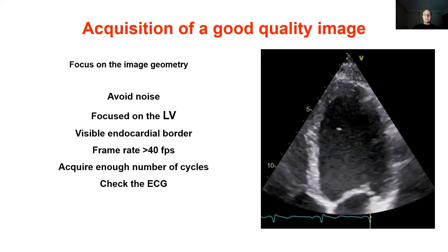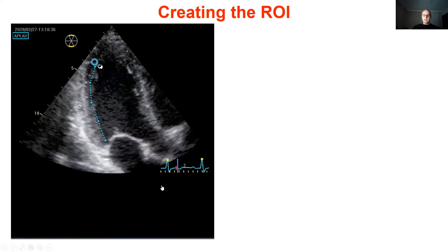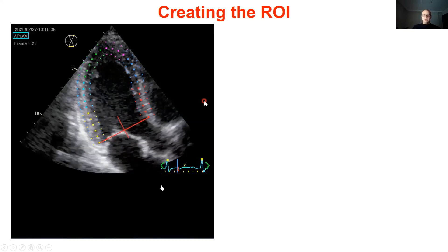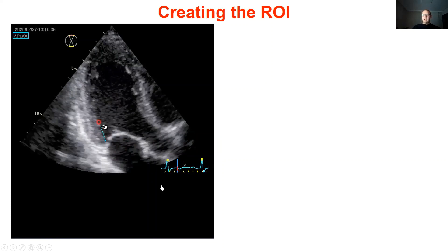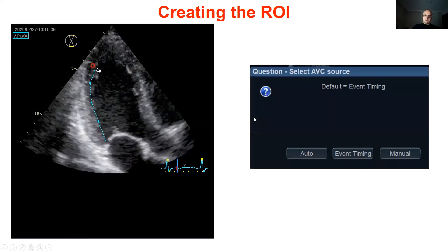ECG should be checked to confirm trigger points are placed correctly at the beginning and end of the heart cycle. For event timing, use Doppler traces to define the exact aortic valve closure time. This can be less important for GLS measurements as many vendors represent the peak strain over the entire heart cycle, but event timing still matters. After defining event timing, you can start creating the region of interest by identifying the endocardial surface by manually placing the appropriate number of markings. If tracking is proper, approve it to confirm the region of interest motion is following the myocardial motion, then select your choice for aortic valve closure timing definition.